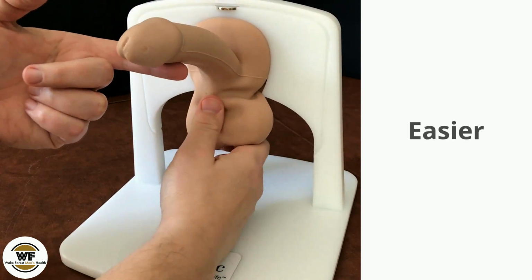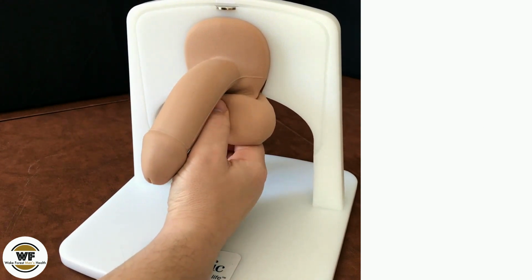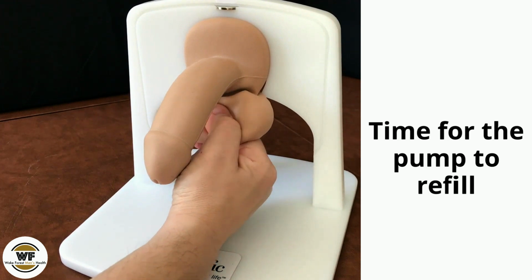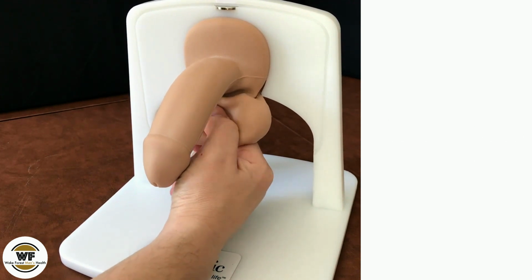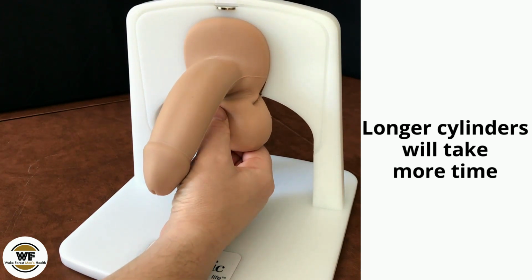Subsequent pumps are easier. As the skin in this area is delicate, I advise men to press gently at first. Allow time for the pump to refill with fluid after each squeeze. Recognize that longer cylinders will take more time to fill.